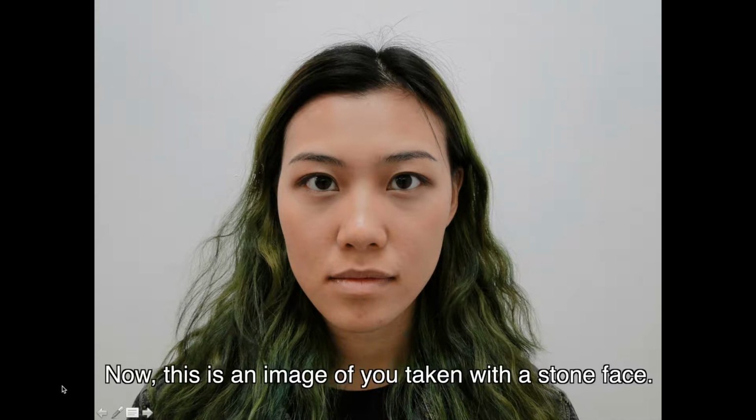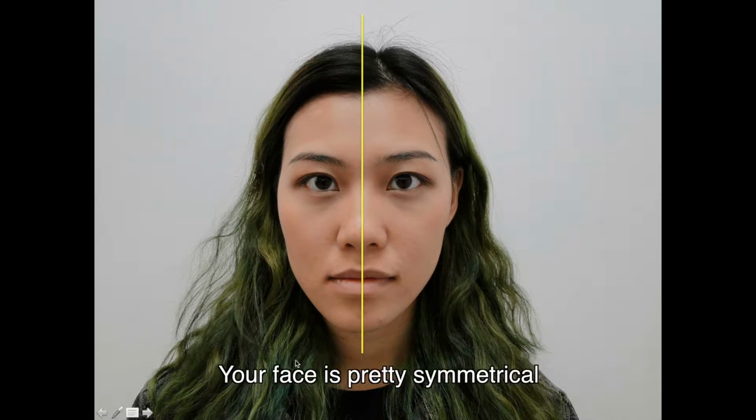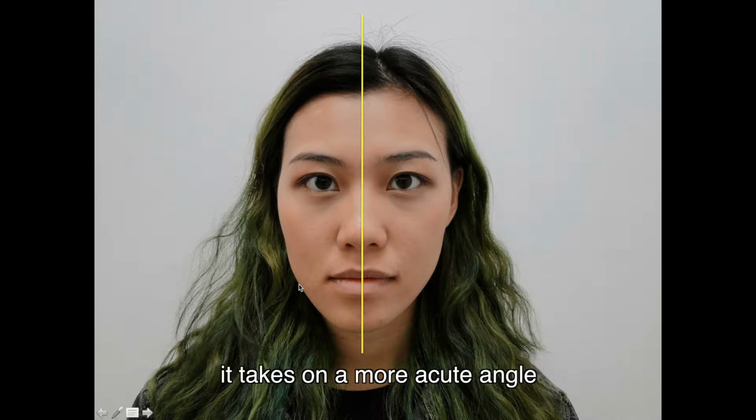Now this is an image of you taken with a stone face. Let's see if your face is symmetrical. We bisect your face. See that? Your face is pretty symmetrical. Except, if you notice on the right side, this mandibular angle, called the soft tissue gonial angle, takes on a more acute angle.